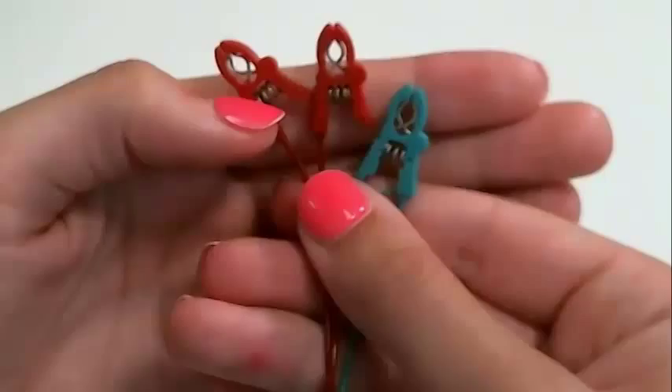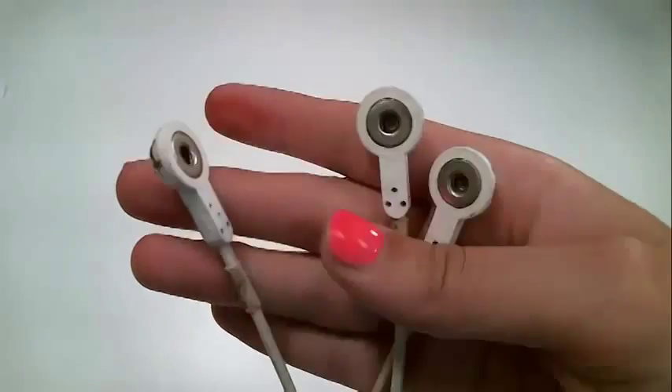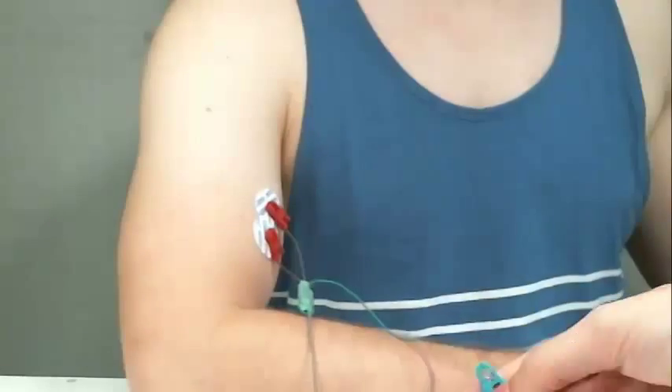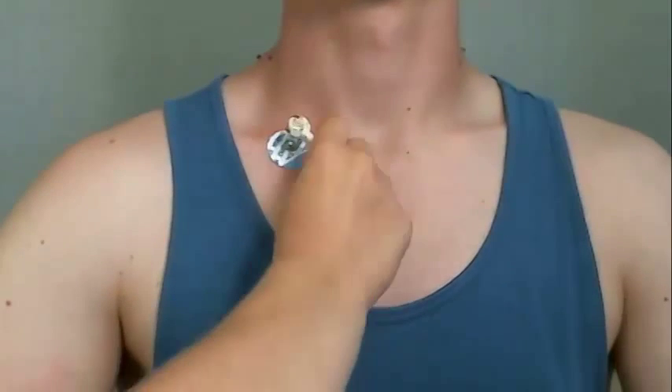Next, attach the heads of the leads to the electrodes. The lead head might look like an alligator clamp or a circle snap — attach them appropriately. Each lead has two heads; it does not matter which head attaches to which electrode. The third and final lead head attaches to the ground. Most commonly, this lead head is green and the lead is longer than the others.